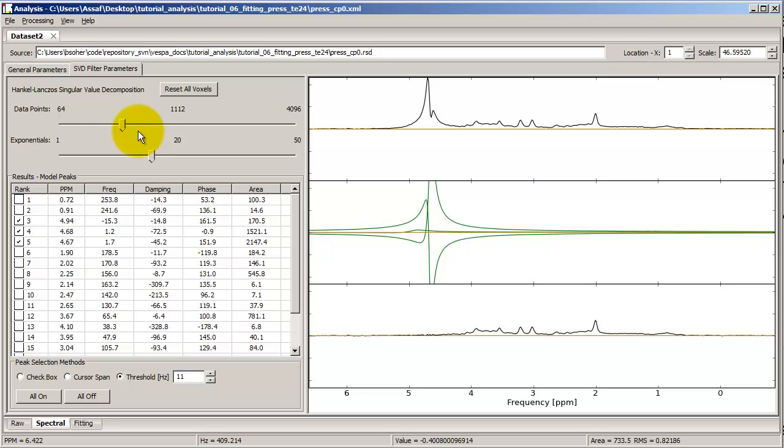So this is it. This is the SVD filter, and use it to take out unwanted peaks in your spectrum, or as a very, very crude fitting algorithm. Although once again I have to say it's not a real fitting algorithm. A real fitting algorithm needs a good model, but maybe as a good starting point for some of the guesses that will come down the road.